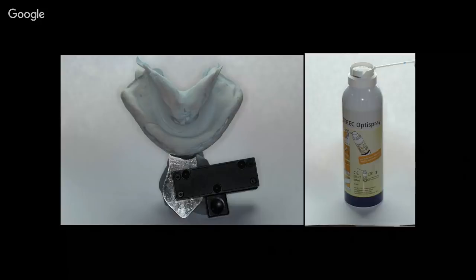I don't have numbers to throw at you, but I can tell you that I would advise using a bonding agent between them. I'm going to blank right now on the name of it, but Anaxdent has a good material for bonding denture teeth or all kinds of materials, composite to PMMA, PMMA to bisacryl. And so it's a great all-round bonding agent that you can use between this. And in addition, the nice thing about these Nobilium teeth is that they have some built-in retention. So there's a lot of mechanical retention. And then furthermore, I go beyond that and I use a high-speed handpiece and I cut some diatorics into the underside of the teeth. So I'm just hedging my bets and assuming maybe there's going to be issues with the tooth popping out, and I'm just taking a shotgun approach: bonding agent, diatorics, all of that stuff.